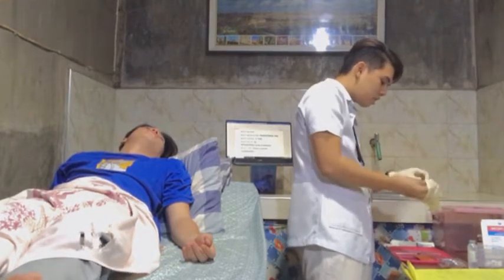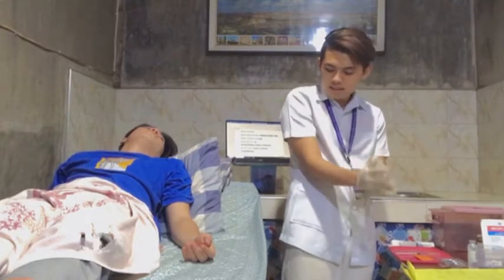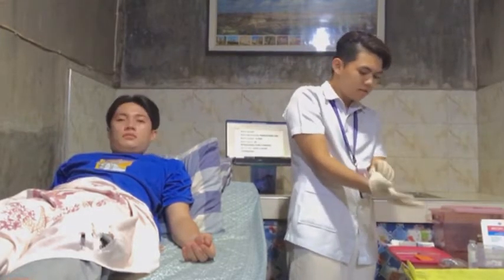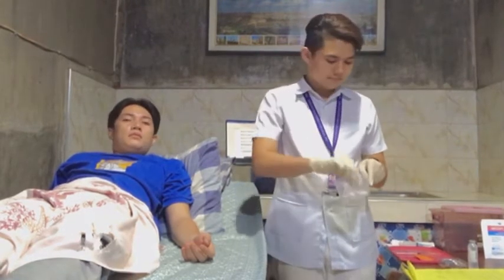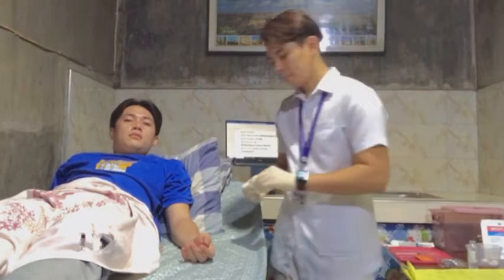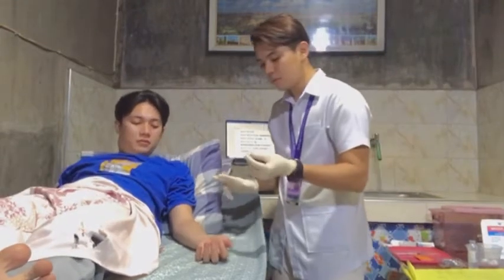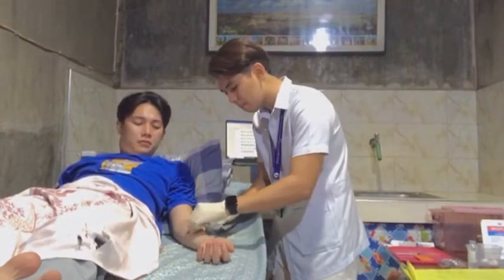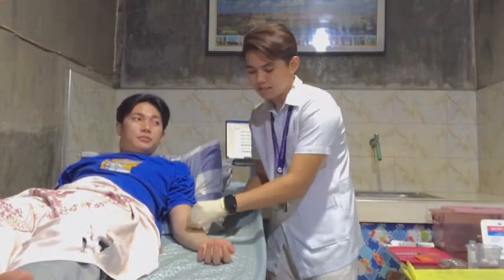the next procedure is that we will be cleaning or disinfecting the area with a cotton ball soaked in 70% alcohol. Or of course, use an antiseptic swab to clean the sites. Of course, begin at the center and move in a circular motion outward about 2 inches or 5 centimeters. Okay, sir. Thank you.